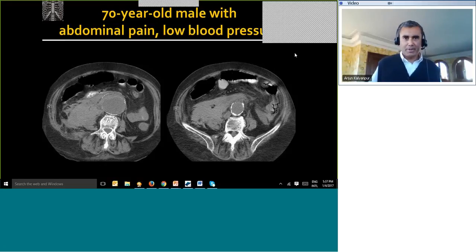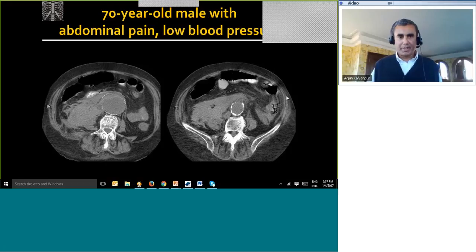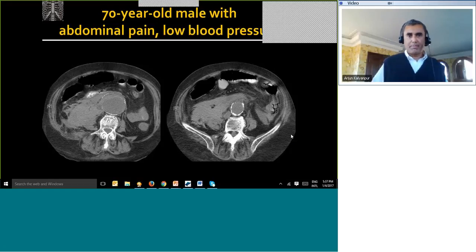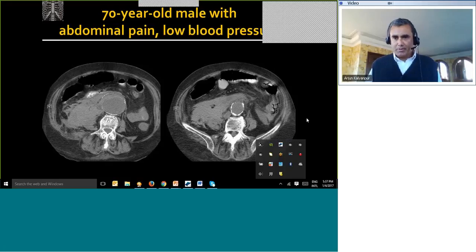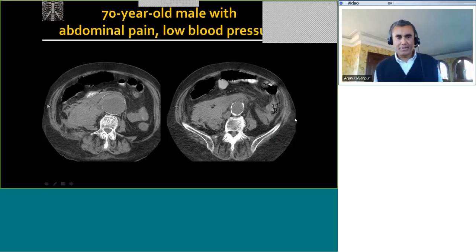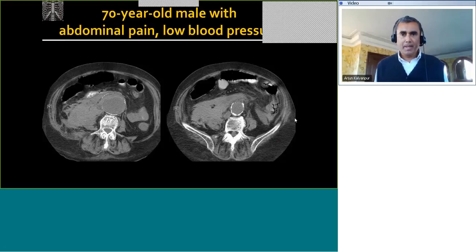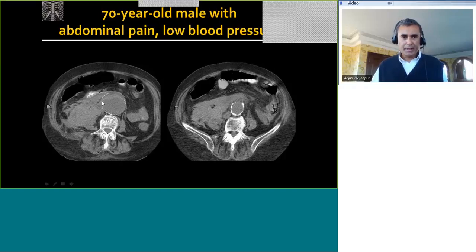Here is the first case, one of those very obvious things. Please feel free to put the answer in the chat box. We can all see that there is a large abdominal aortic aneurysm, and the aneurysm has disruption in its contour right here. There is also a hyperdense crescent within the aneurysm. This is a rupture of the abdominal aortic aneurysm with a large retroperitoneal hematoma.